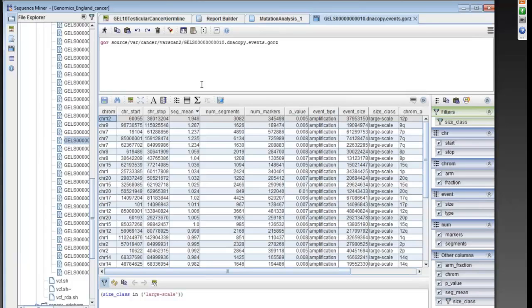We also did a follow-on analysis to look for a different kind of structural variation, looking for fusion events and translocation. Doing this, which I'm not showing here, requires a little bit of additional analysis. We found a fusion event occurring in the NUT1 gene, a translocation event between chromosome 5 and 15. NUT1 fusions are well known in cancer. They're associated with what's called midline cancer and indicate an aggressive form of the cancer.